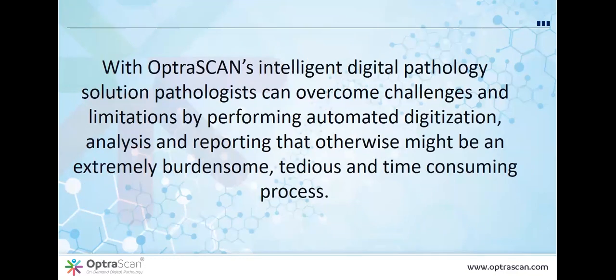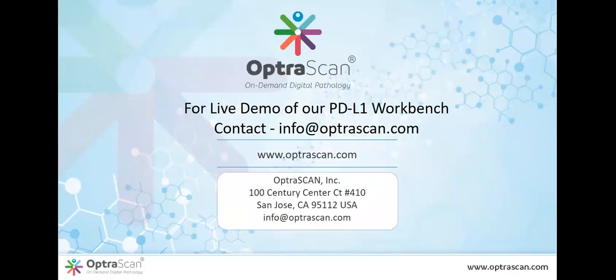Isha, one comment there is that the algorithms as a set of tools can be applied to many immunohistochemical evaluations, but an algorithm designed for PD-L1 cannot be used for HER2. You have to use the algorithm for the application for which it was developed. And for example, even if you're looking at nuclear stains like Ki67 versus ER, they're not translatable. They have to be validated for the marker in question and ideally for the platform and the immunohistochemical stain in question. Absolutely. Absolutely, Dr. Taylor.